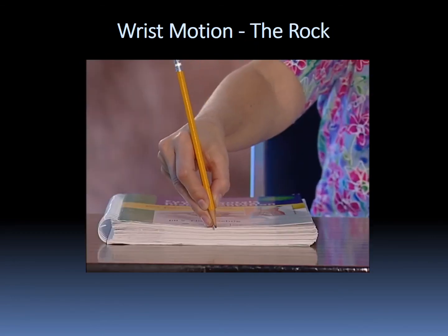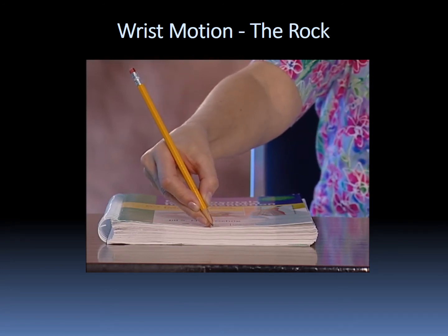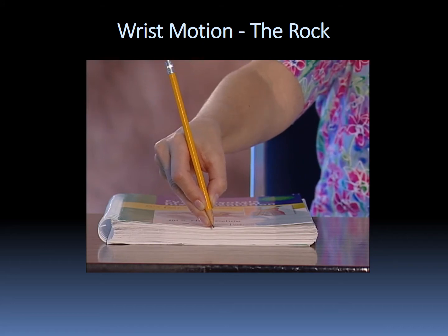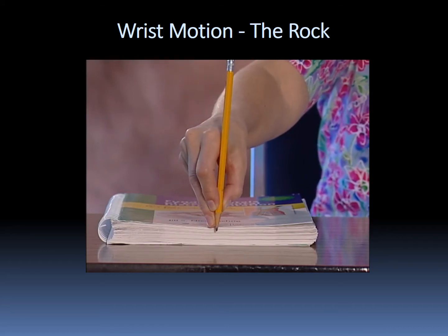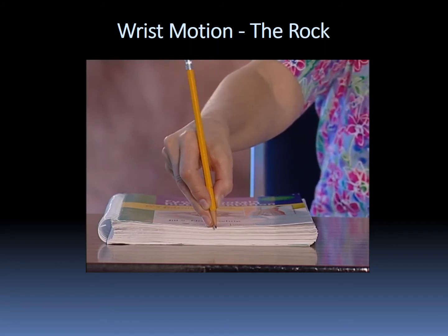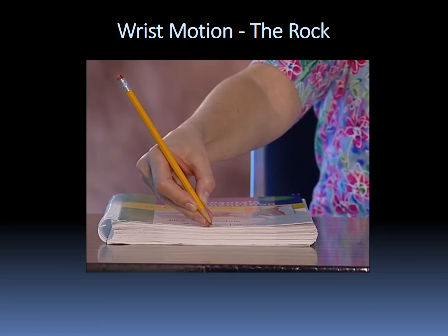Motion activation to move the pencil tip or probe by rotating your hand and wrist away from your body. During this movement, your ring finger should remain motionless, pressing down against the countertop. Return the pencil or probe to the original position by rotating your hand and wrist back toward your body. Practice making this wrist activation motion several times.